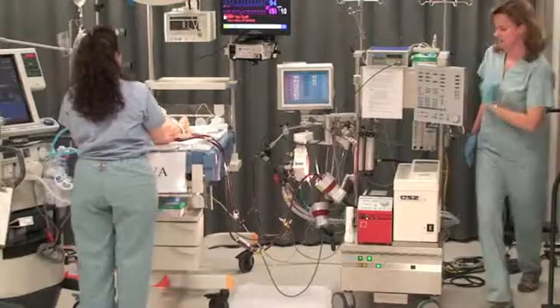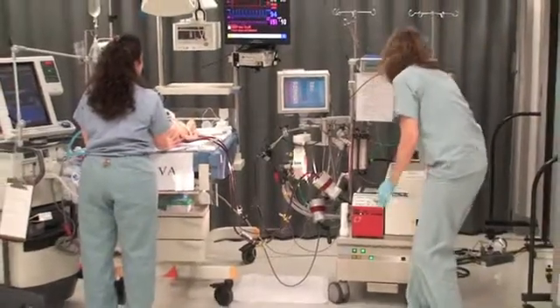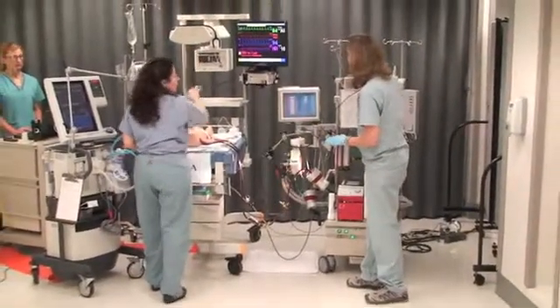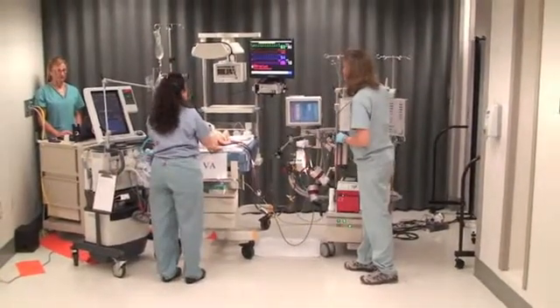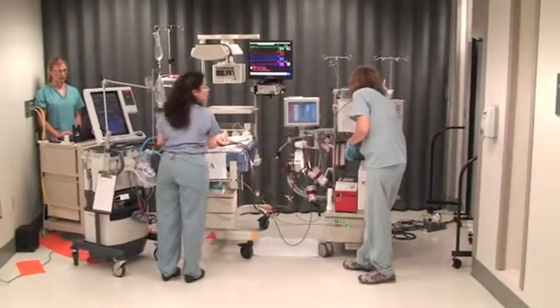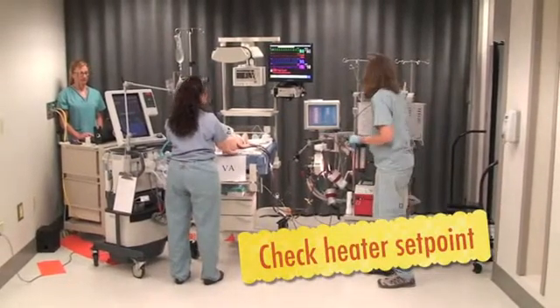Our heart rate's still kind of low, but it's only in the 80s. I don't think we need to come off as long as she doesn't get more bradycardia. Does it look like your heater's coming on okay? Yep, I'm resetting the temp.